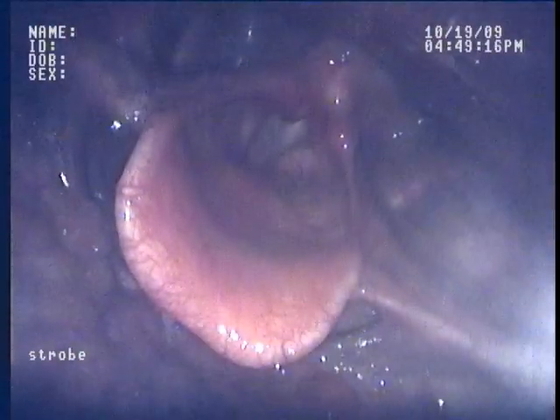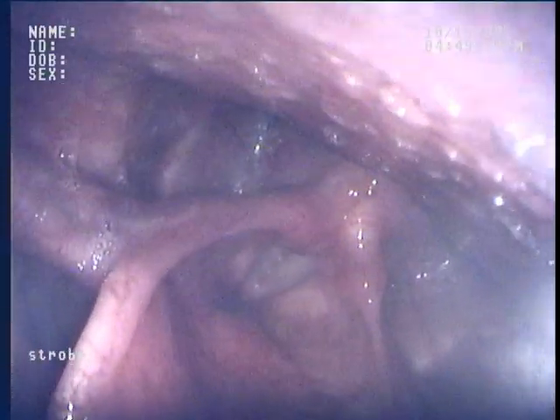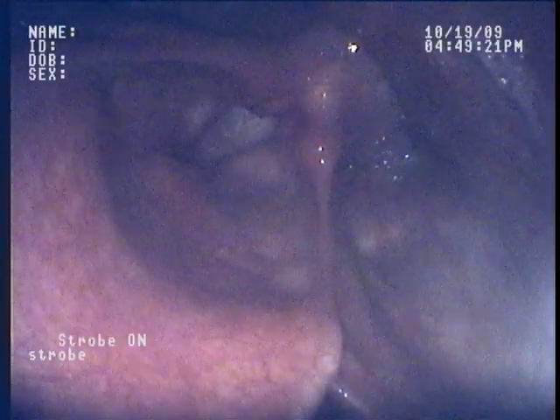These are the vocal cords. You can see as the stroboscope acquires the frequency of vocal fold oscillation. You can get synchrony, or view this in slow motion.